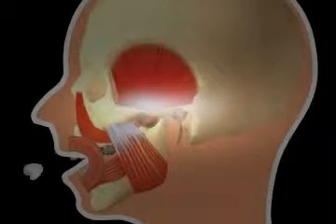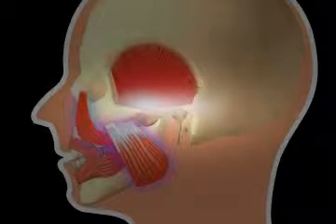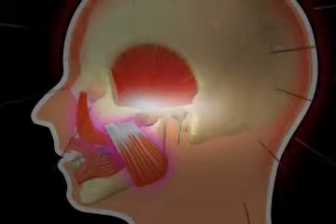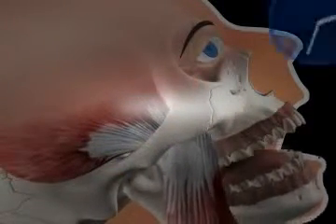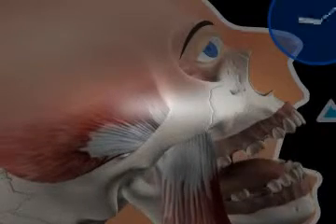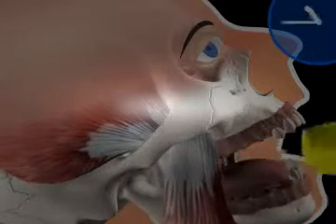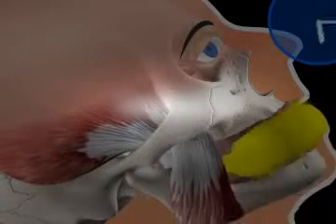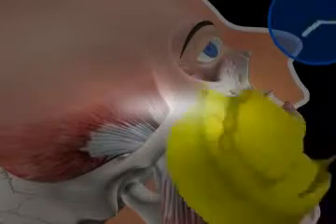If the lower jaw is pressed into an unfavorable position, for example due to a bad dental prosthesis, it can cause facial pain, jaw joint pain, and even headaches. In individuals with a full set of teeth, the position of the jaws is determined by the dentition. In persons without any teeth, or with very few teeth, the dental technician needs information about how the jaws relate to one another in order to be able to correctly prepare the dental prosthesis. A bite analysis will demonstrate the jaw relationship to the technician.